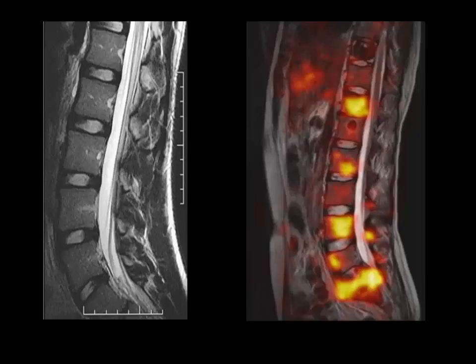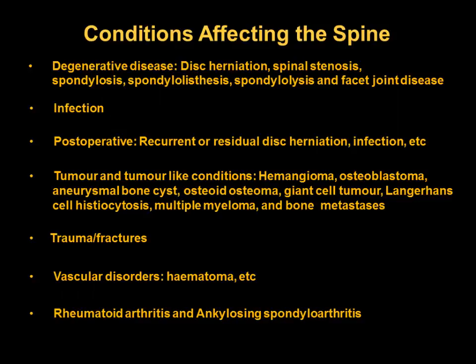We have been dealing with the imaging, and we have got the Center of Excellence Orthopedic Center, the National Orthopedic, which is in Stanmore, and they refer patients. All these patients have been screened with CT, MRI, and all other sorts of imaging, plain films, and it's been inconclusive. The patients have been having continuous pain, and the patient has had surgery for the symptoms, and they have not resolved. So all these are problematic cases. I'm not going to talk about the MR. We have been doing PET MR with fusion now, but that will be a different talk.